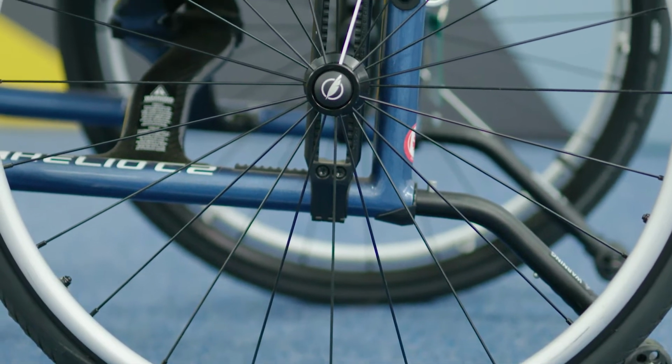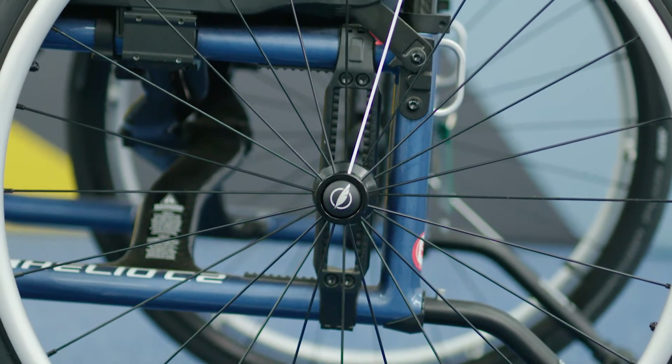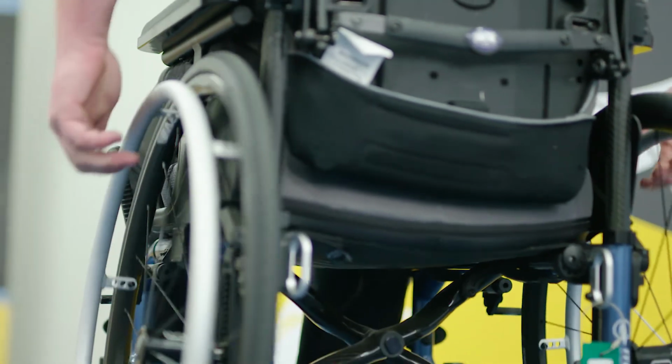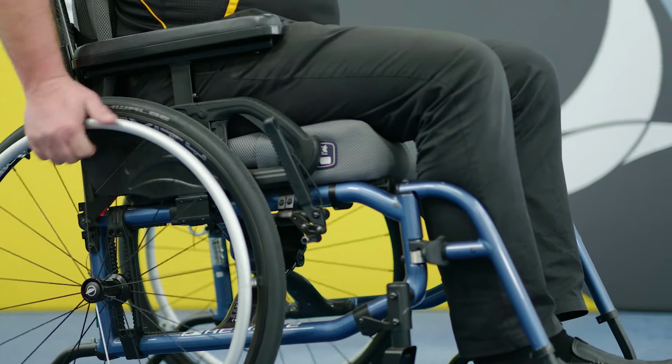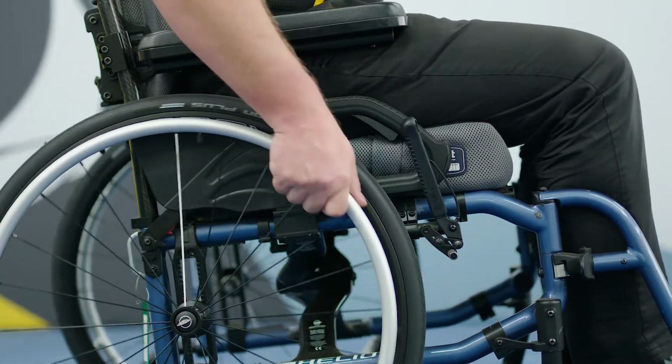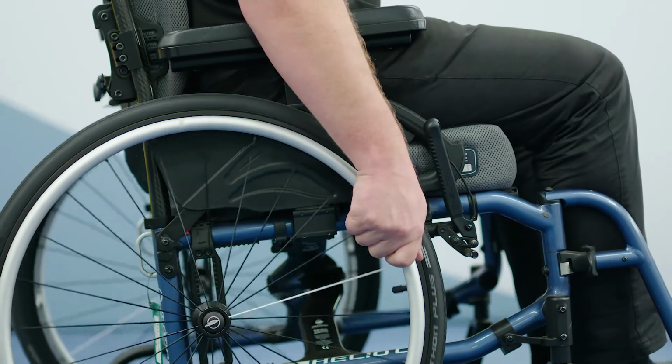For example, aluminium, carbon fiber, and titanium offer dampening effects, however to varying degrees, with titanium and carbon fiber offering higher levels of dampening effect. Why consider vibration dampening? There's less vibration experienced by the body of the user and more absorbed through the wheelchair.